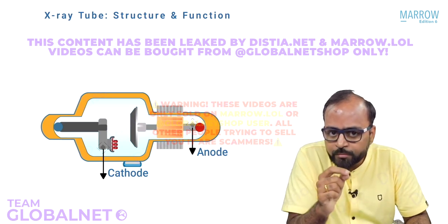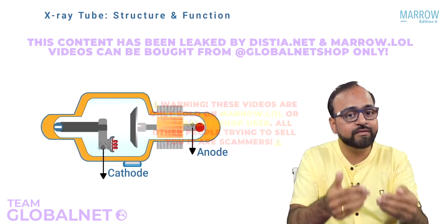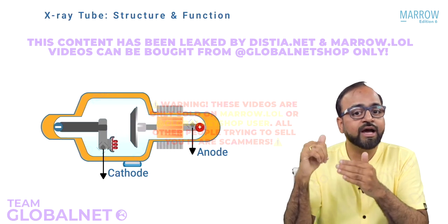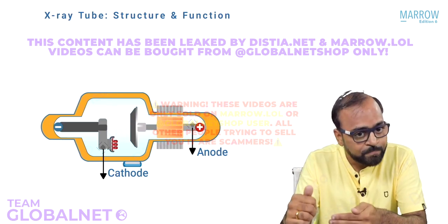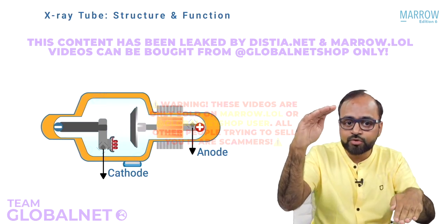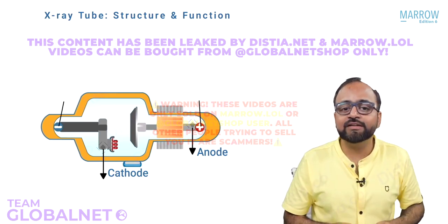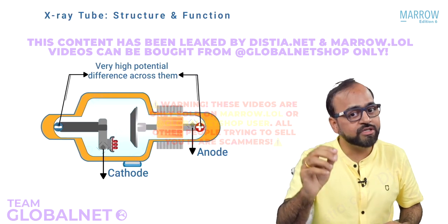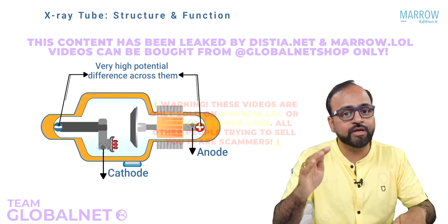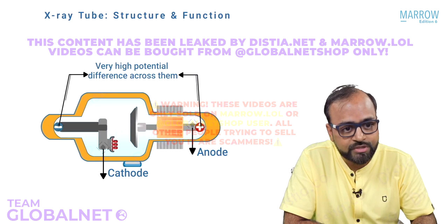But before we go there, remember, why is the cathode called a cathode? Because it is given a very high negative charge. So it is called cathode. The anode is given a very high positive charge, so it is called anode. So just see, cathode is very negative, anode is very positive. And so if you look at the potential difference between the cathode and anode, I hope you realize that this is a very, very high potential difference, isn't it? This high potential difference between the cathode and anode plays a very important role in production of X-rays. How? We are going to see that.